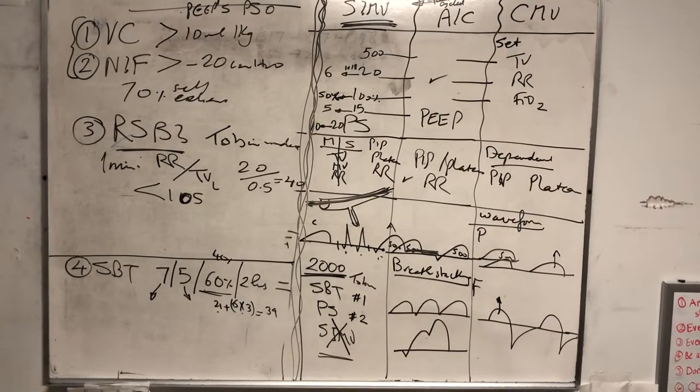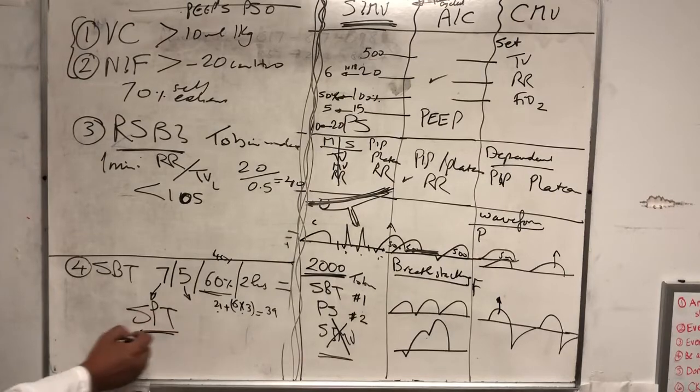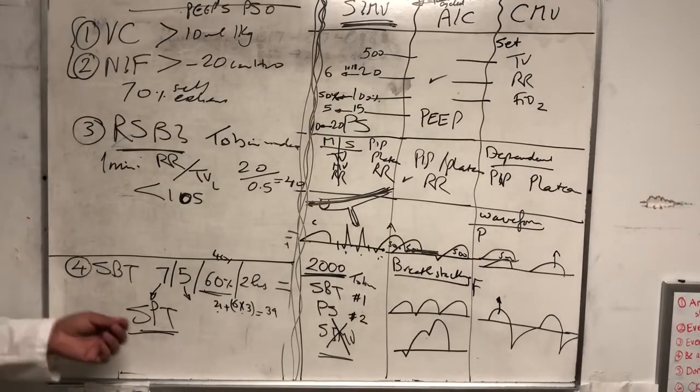Can't do that. So that's why we coined the new term. Don't use it anywhere but here. It's called the SPT, right? The SPT is spontaneous pressure trial.